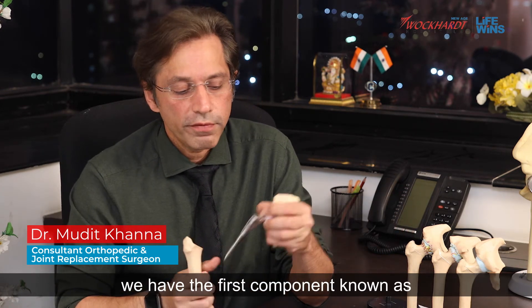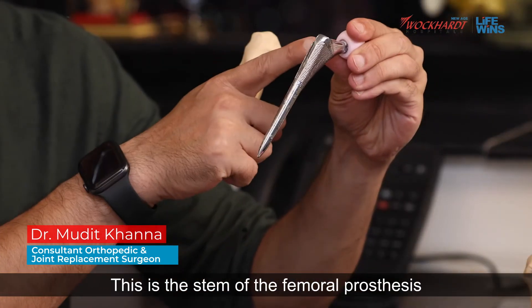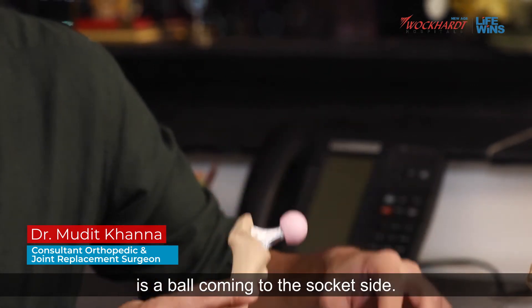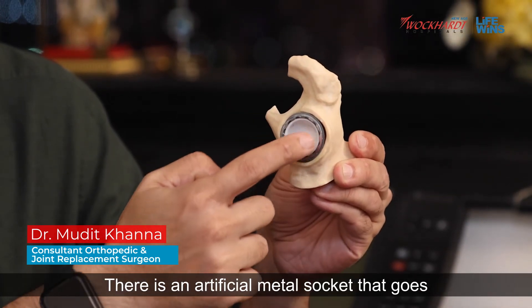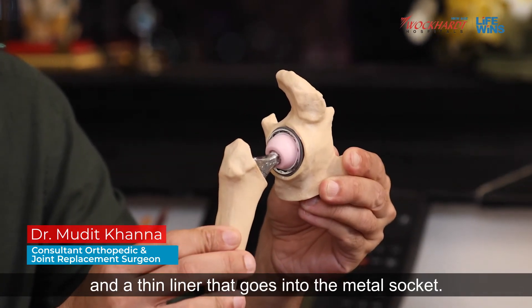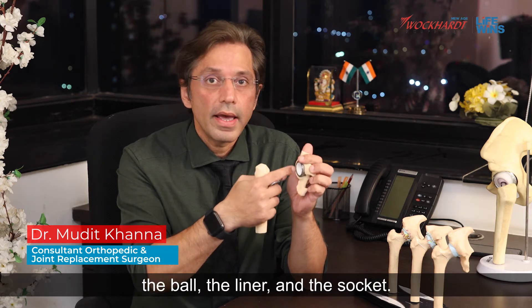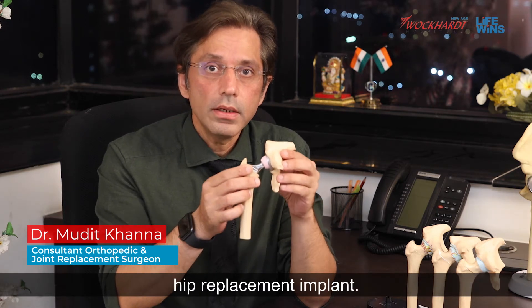The first component is known as the femoral component — this is the stem of the femoral prosthesis that goes into the thigh bone or the femur. On top of this component is a ball. On the socket side, there is an artificial metal socket that goes into the acetabulum, and a thin liner that goes into the metal socket. Essentially, we have four main components: the femoral component, the ball, the liner, and the socket. Together these four components make up the entire hip replacement implant.